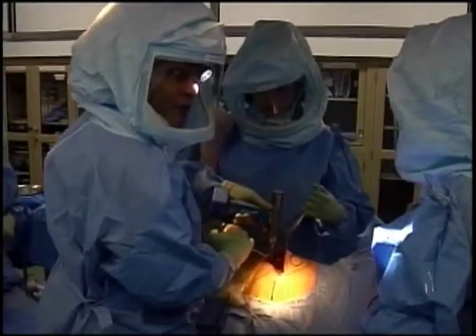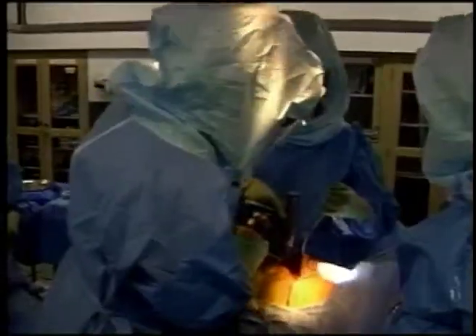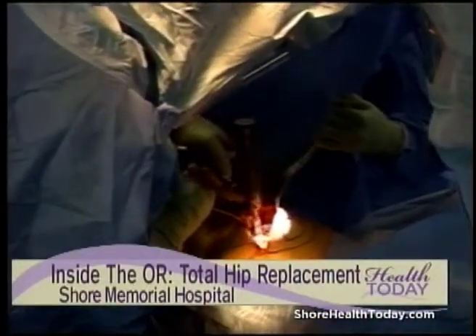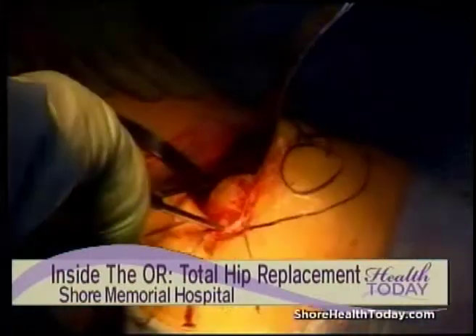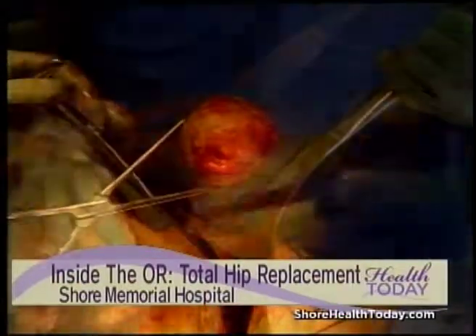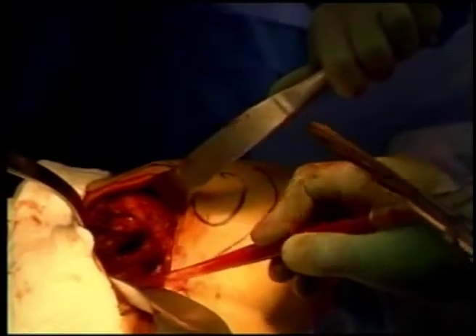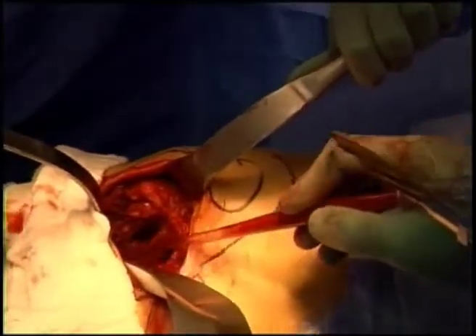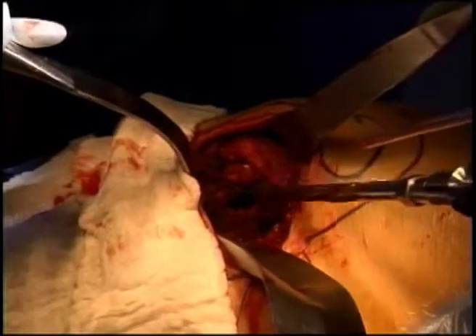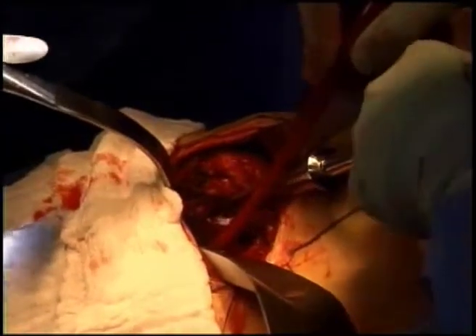To remove the hip ball, we use a saw to cut the ball off the neck of the femur. After the neck has been cut, the arthritic hip ball is removed from the patient. Having removed the femoral head, we're now preparing the thigh bone for the stem. We're looking down the cut surface of the femur, and to start, we open up the bone by inserting a small reamer into the center of the bone, which will serve as a guide for shaping the thigh bone with a broach.